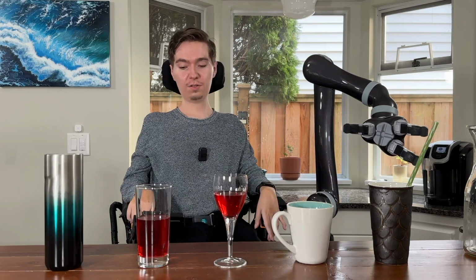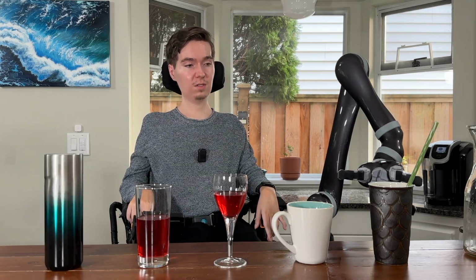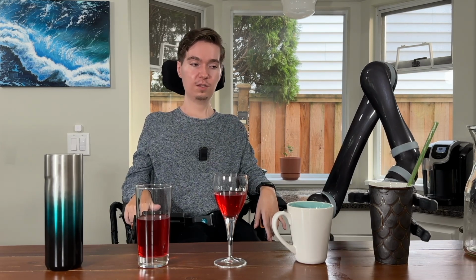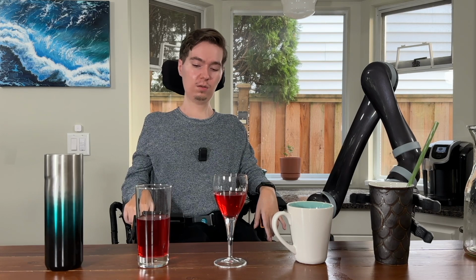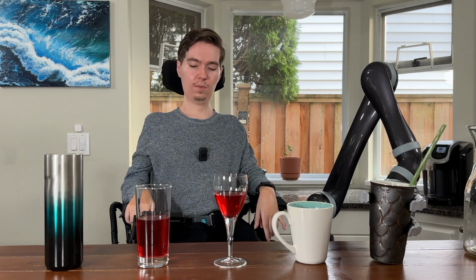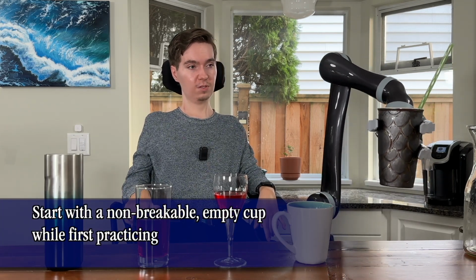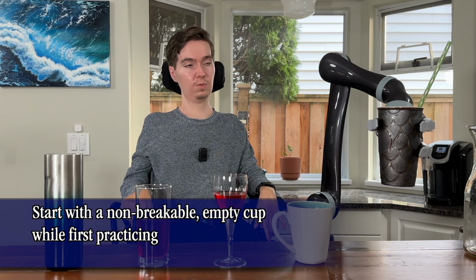So I'm going to start with probably the simplest of these cups, the one with the straw. The straw makes this very easy, and again, Jaco works with and without the straw, which you'll see very shortly, but let's just start with this one. So we're going to lift it up and make sure it stays straight, and we're going to bring it right up to our mouth.